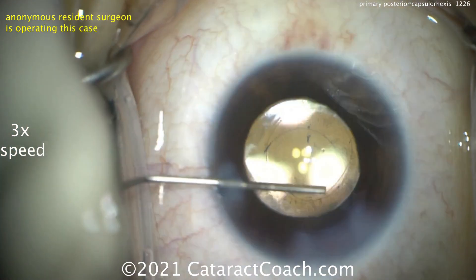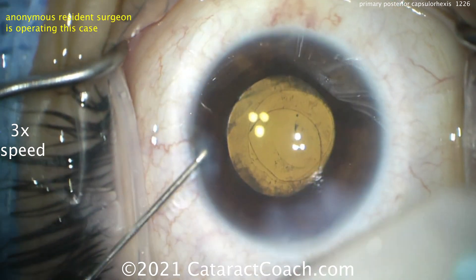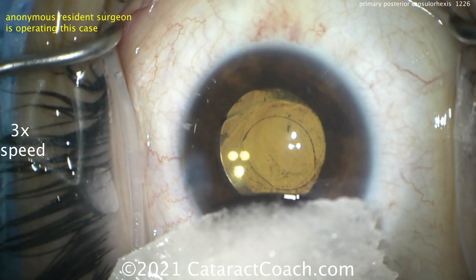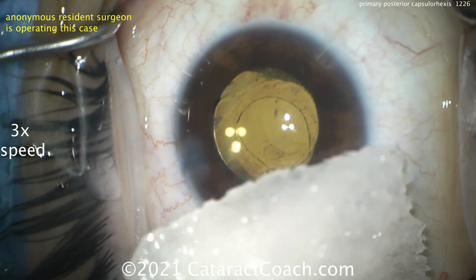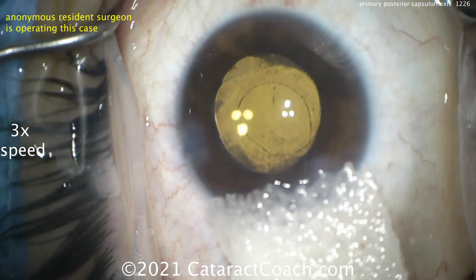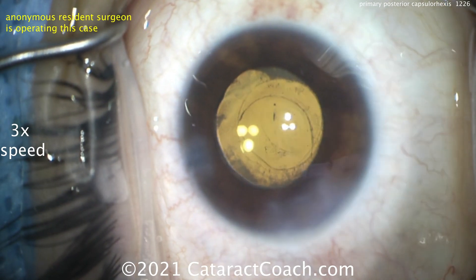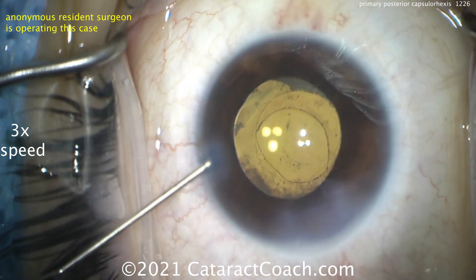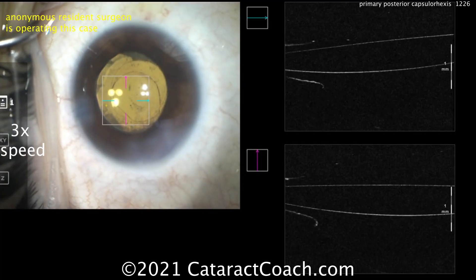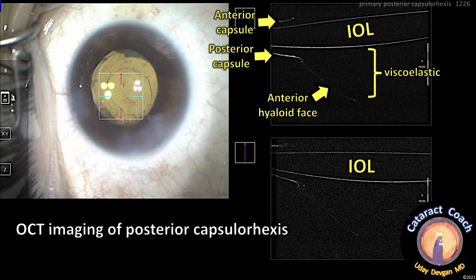This is going to be a beautiful outcome for this young patient. What about refractive goals? In this case, we chose a refractive goal of about minus one for the patient, which will give her good all-around indoor vision, and she doesn't mind wearing glasses to drive. There's the incision being sealed up. Let's look at the OCT imaging — we're fortunate to have this technology on our teaching microscope. There's the OCT — that's the IOL — and there's an anterior capsule and a posterior capsule. A little bit of viscoelastic there, and the anterior hyaloid face is intact.